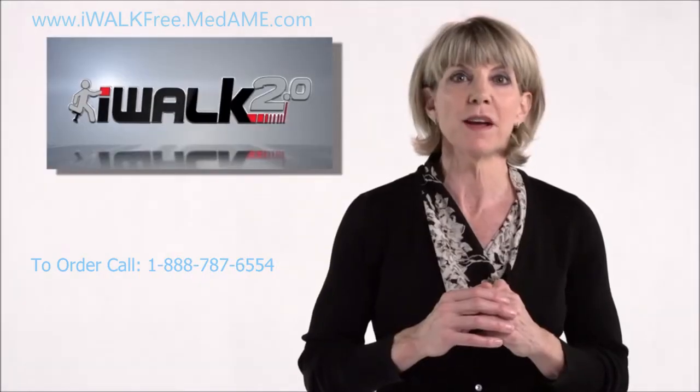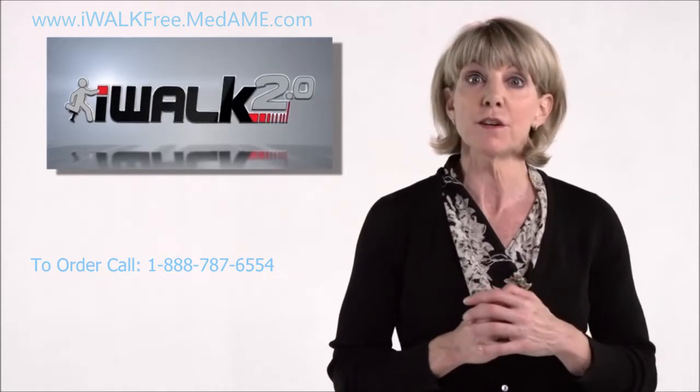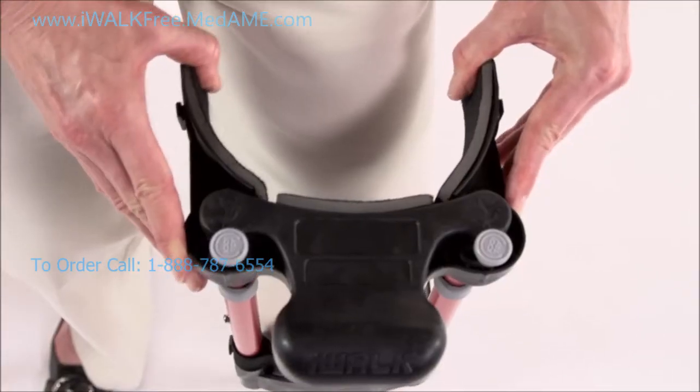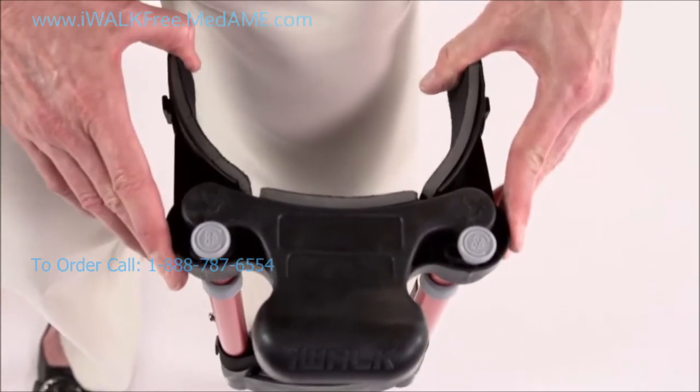It's really critical to make sure these thigh supports are locked in. If they slip, the stability of the crutch is compromised. So double check by flexing the thigh supports in and out to make sure they're firmly in place.